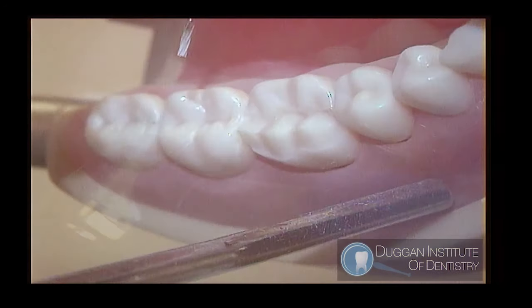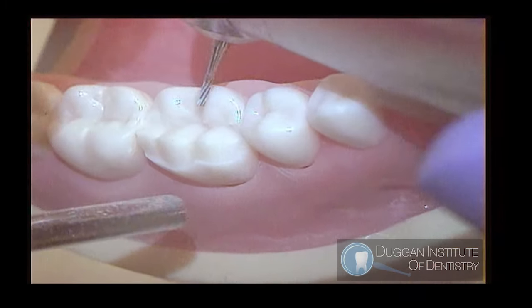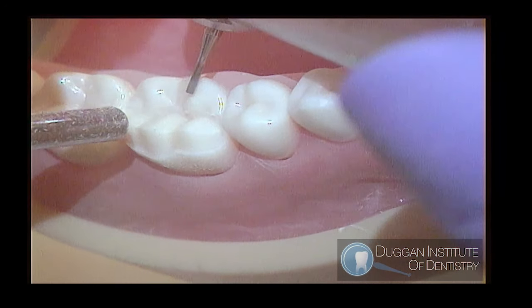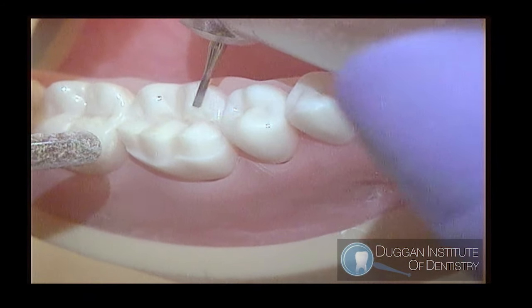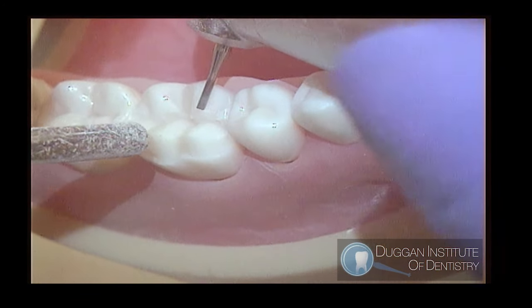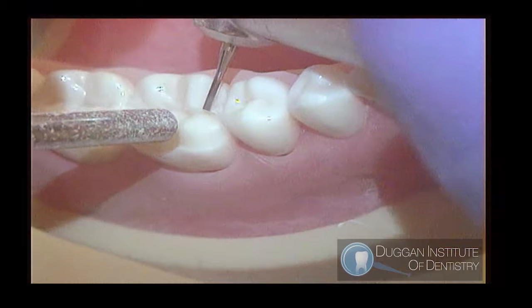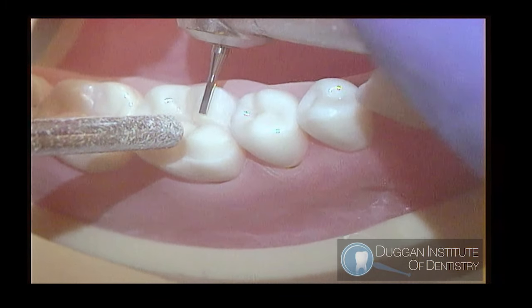Reduction of the lingual cusps, the non-functional cusps, also referred to as the C-plane. Starting with the mesial lingual cusp, we reduce half of the cusp at a time, placing the burr parallel to the ridge, pointing in the central groove. Gently reduce the cusp from the occlusal down to the central groove, creating a measurable ledge of 1 mm to 1.2 mm. Reduce half of the cusp to the marginal ridge, reduce the other half out through the lingual groove.